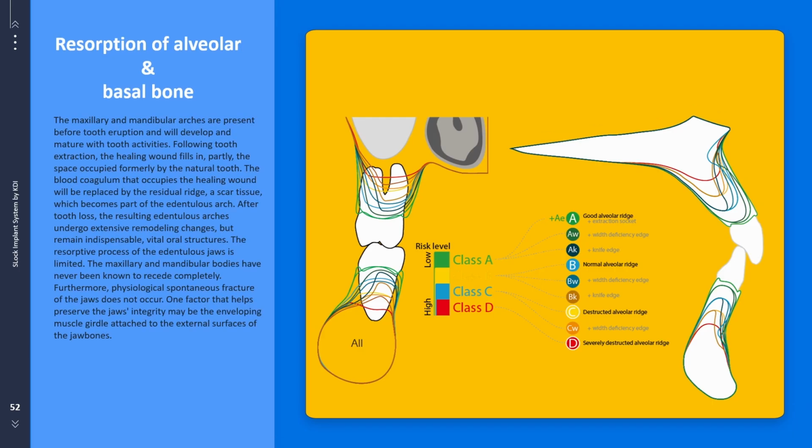When anterior teeth are lost, bone resorption occurs in this manner. If you want to fabricate a screw-retained implant prosthesis, how should the fixtures be placed? When severe bone resorption has occurred, it is difficult to place implants according to the requirements of screw-retained prostheses. It is simply not feasible. If fixtures are placed according to the anatomical structure of the residual bone, the likelihood increases that angled stock abutments or custom abutments will be connected with abutment screws, and cement-retained prostheses will be required.